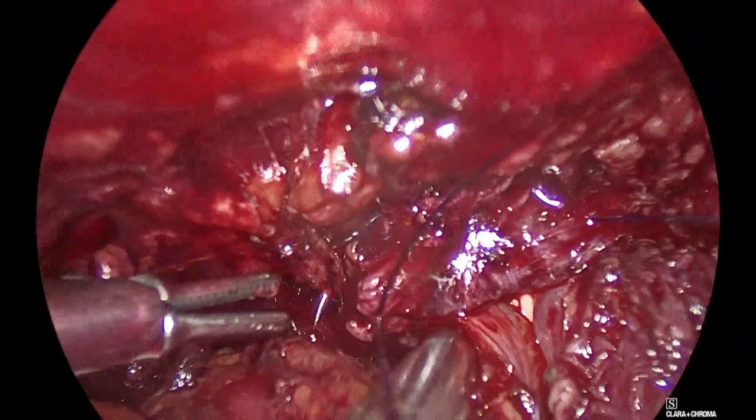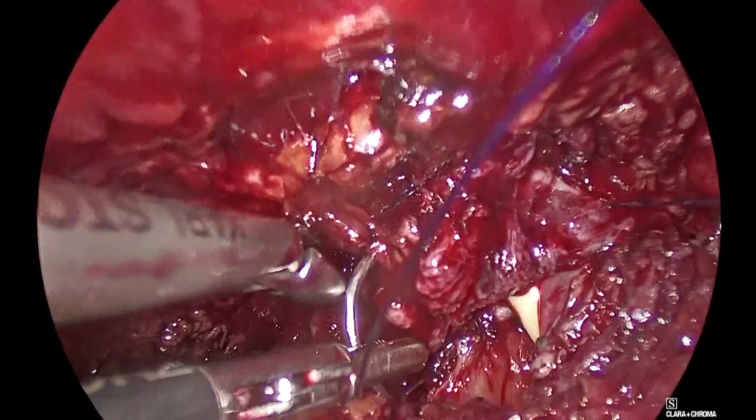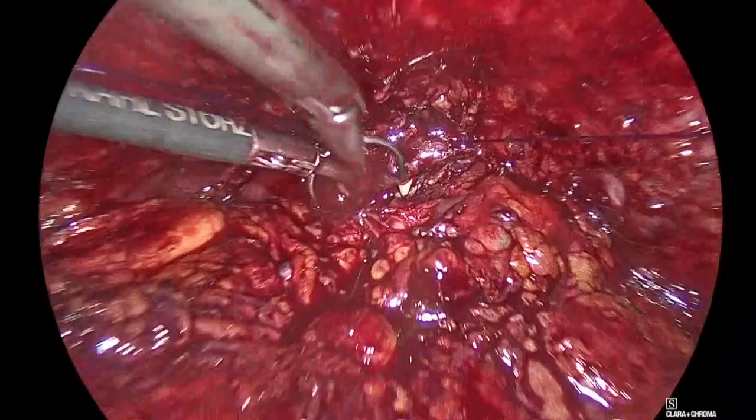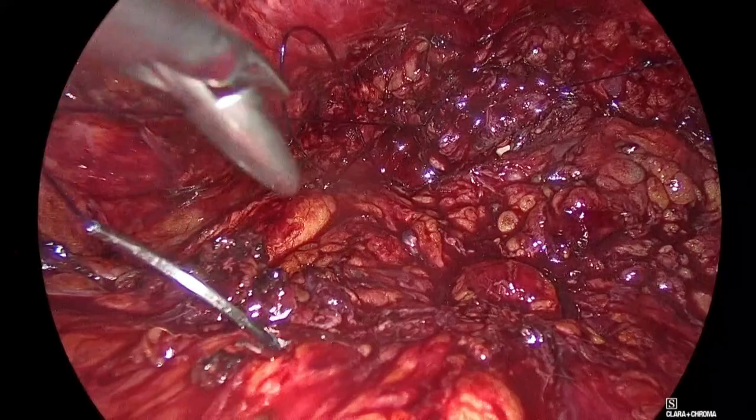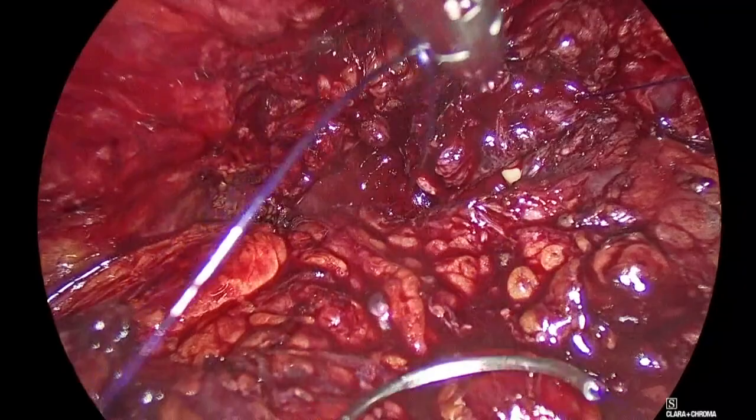Go back. Wait. Go back. It's important here. Be careful. Come close. Make sure that you're not crossing your sutures. Go back. Wait. These needles here, you need to be... Let's see. Is it crossed? It's crossed. Okay, you need to check this, because if it's crossed, you need to uncross it. Go back, Padeli.